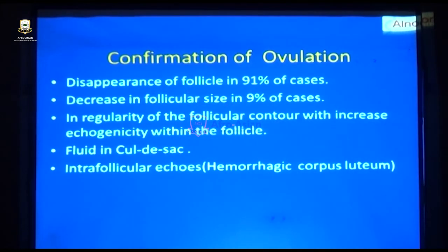That is a diagnostic sign. But fluid in the cul-de-sac, if I see it just today for the first time, the fluid may be luteal, the fluid may be inflammatory. So who knows, it was there before, it's only present today. So best is to start from day one.